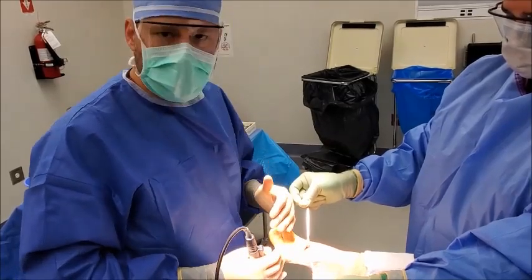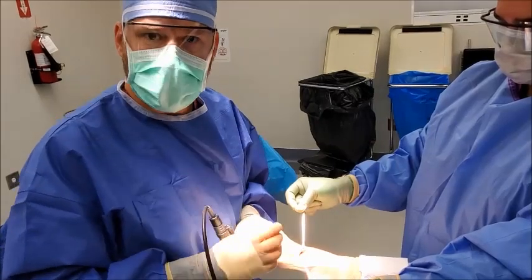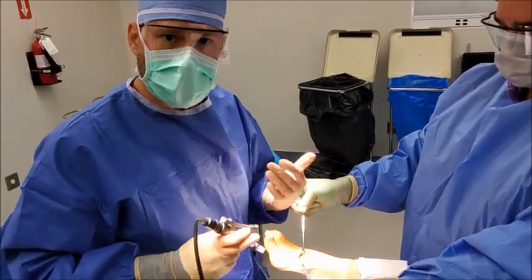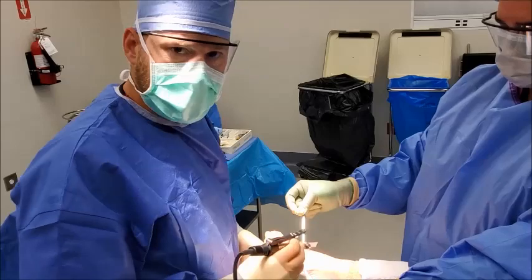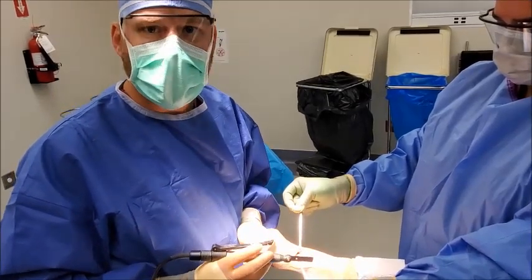In most cases of bunions there is a rotational component about 87% of the time, and that goes unreduced in minimal incision surgery and also more traditional bunion corrections. So we'll be planing that joint to allow that rotation to occur so we can return this patient to normal anatomic alignment.